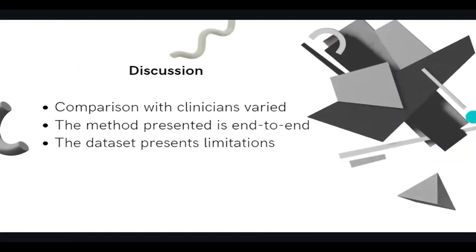Discussing the comparison with the clinicians, the results varied. As you can see, the clinicians from Israel outperformed, but they didn't outperform the clinicians that they worked with. They stated that the clinicians they worked with for the data set were top experts in performing these measurements. So they believe that BabyNet may outperform, say, an average expert that you would see in hospitals that do these measurements all the time.